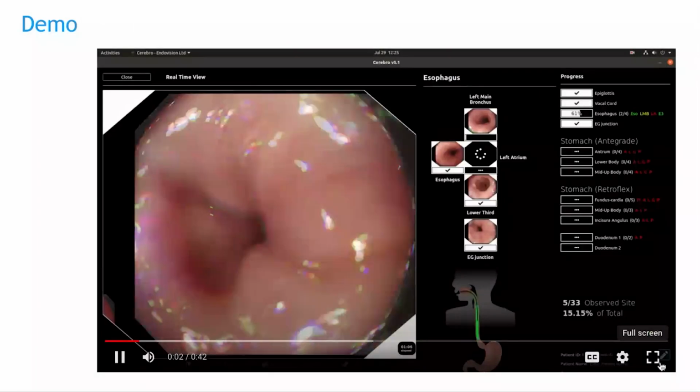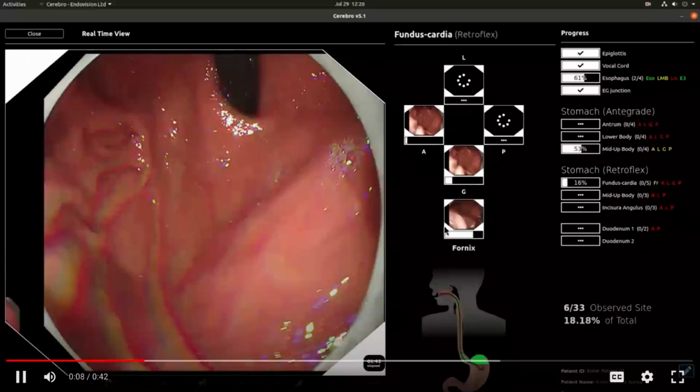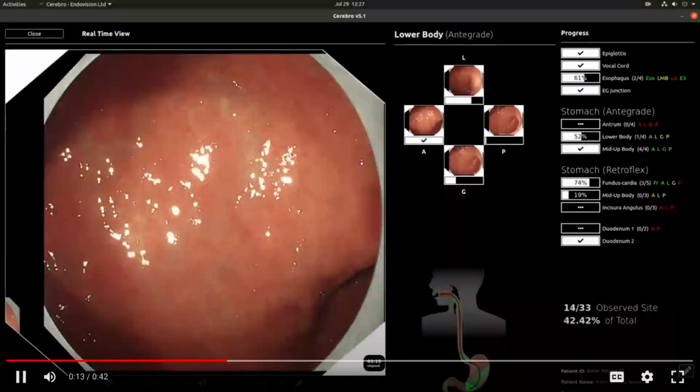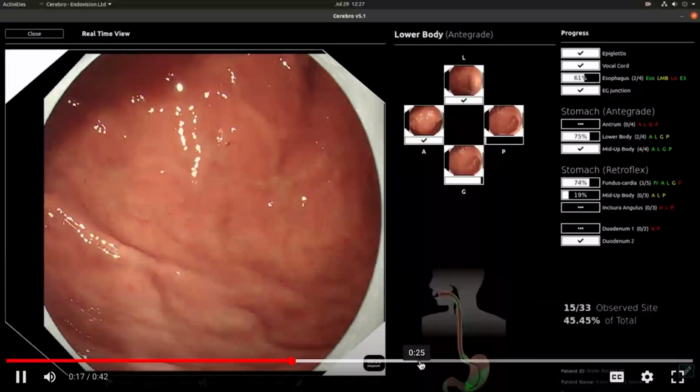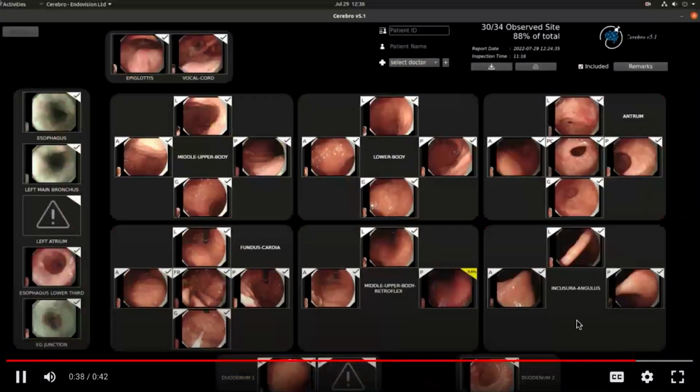So this is a small demo of the application. As soon as the doctor reaches a particular landmark, the progress automatically updates. And at the end of the procedure, once the doctor has inspected the full stomach and taken the endoscope out, our software automatically generates the most representative image of each landmark of the stomach and puts that as a photo documentation. So this is about the application that we are going to see today, and how to build such an application.